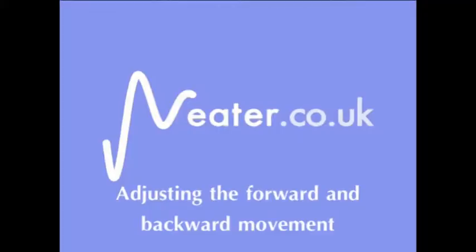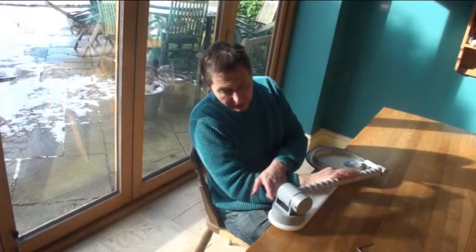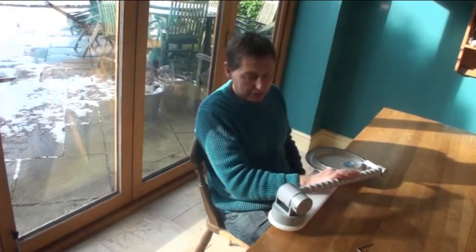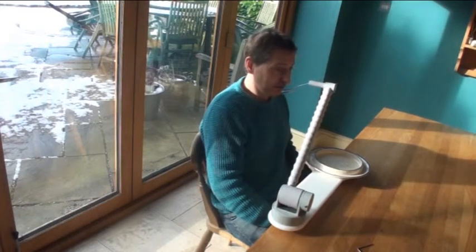Welcome to this brief instructional video. A forward spring attachment can be fitted so that as well as the arm coming up automatically, it also comes forward automatically to your mouth.